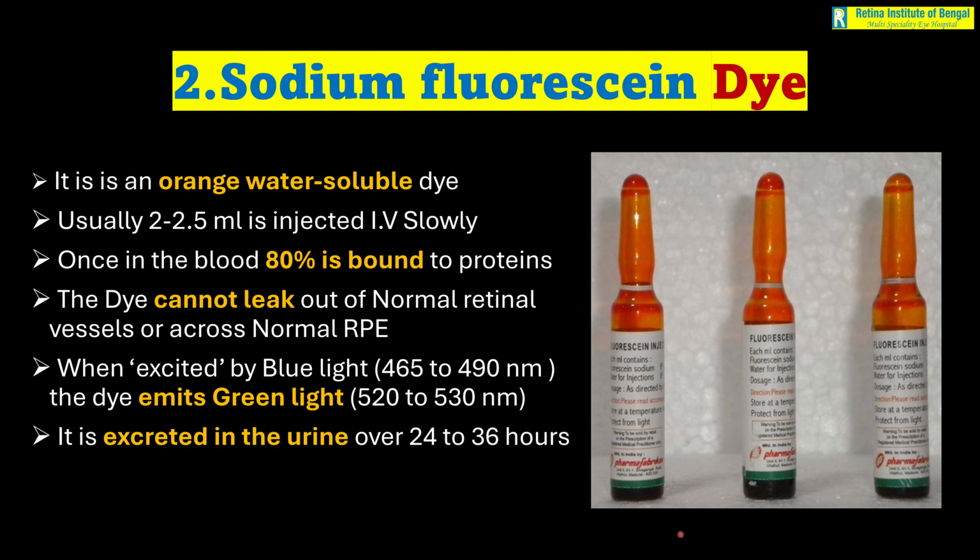And as I have said, this dye is excreted in the urine over 24 to 36 hours. So you must tell the patients that it is likely their urine will be discolored for 1 or 2 days, and that's absolutely fine. They need not worry about it.